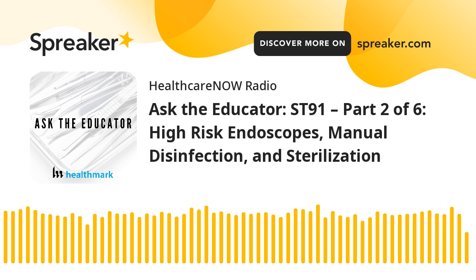That means that the soaker bins that you have where you have high-level disinfectant in them, it might be a glutaraldehyde or an OPA or a peroxide-based chemical, we no longer recommend on a routine basis that you use those to high-level disinfect endoscopes.